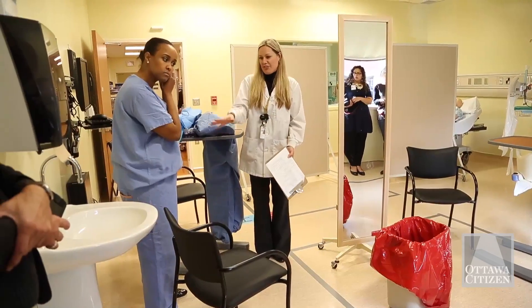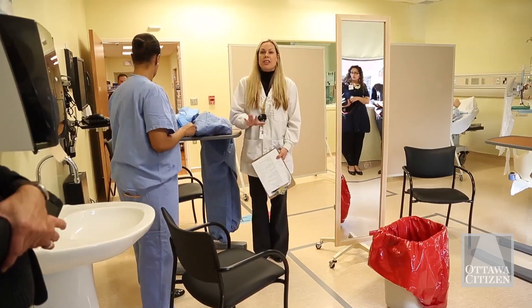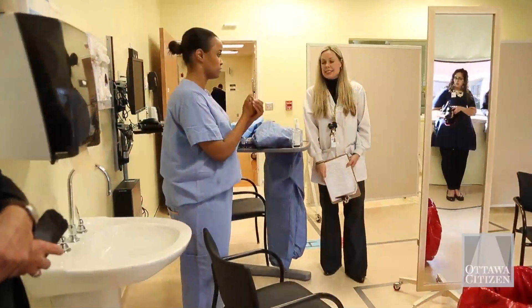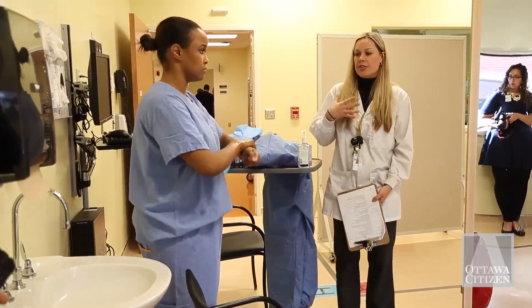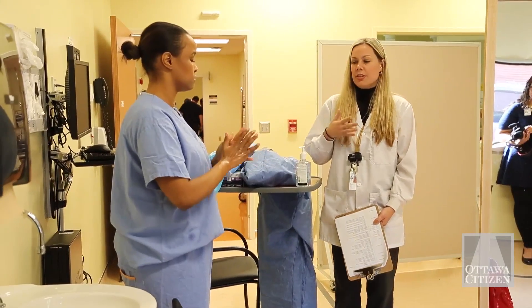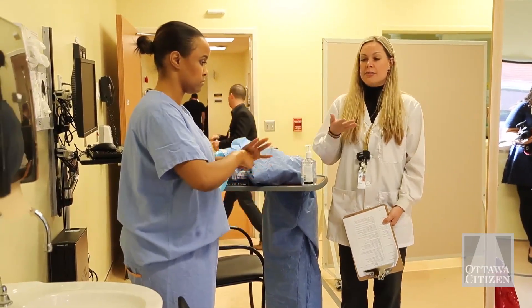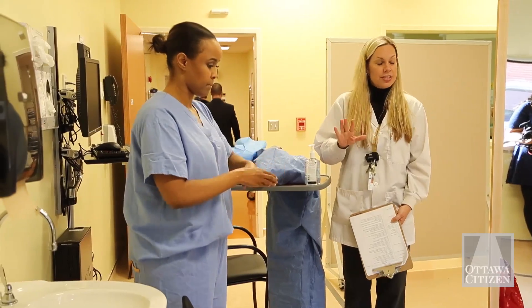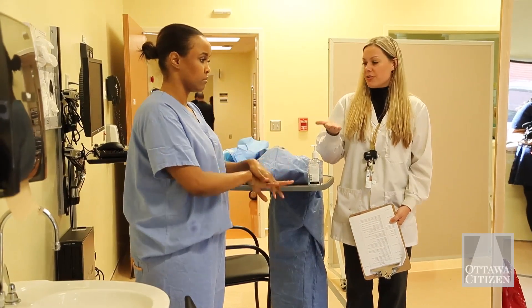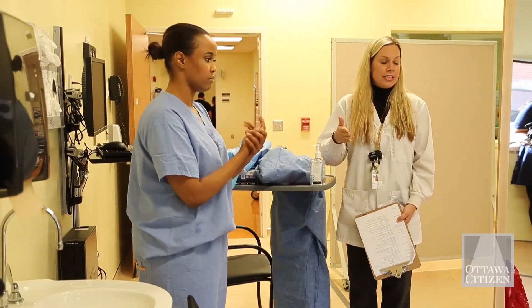Healthcare workers like to carry all sorts of things on their body, so you make sure you empty your pockets and you have nothing on you but your hospital-issued scrubs. As the assistant, this is where I make sure she's applying the rules of hand hygiene — a 15-second hand rub — putting enough Purell on her hands to disperse it over the entire surface, including the webs of her fingers, the tops of her hands, and her thumbs for the 15-second period.